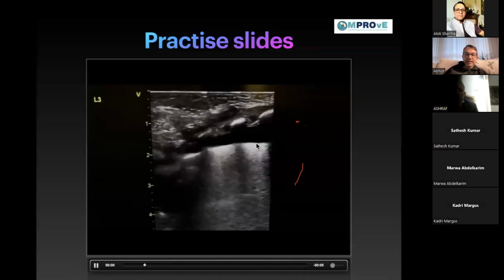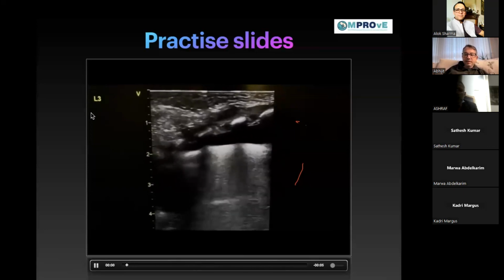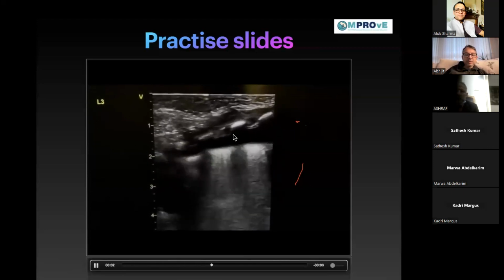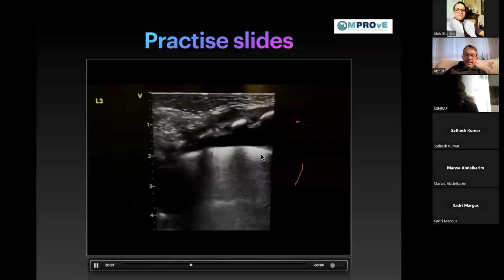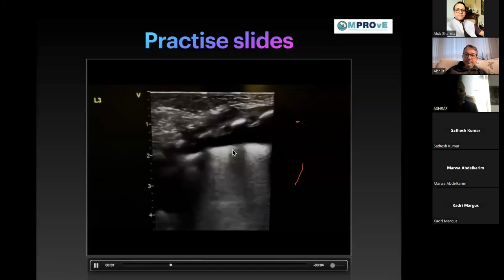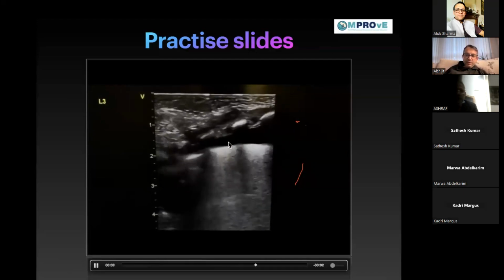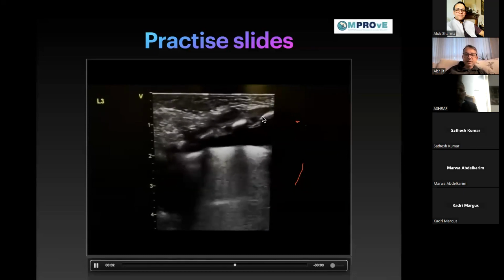When you have seen the pleural effusion, you're not going to skip the other zones of the lung. You're going to go into the detail and do all the areas of the lung, and then shift your focus. Now your focus is sitting somewhere here in the lung, because that's what you have seen, and you are very delighted with your scan. Oh, I have seen a pleural effusion there.